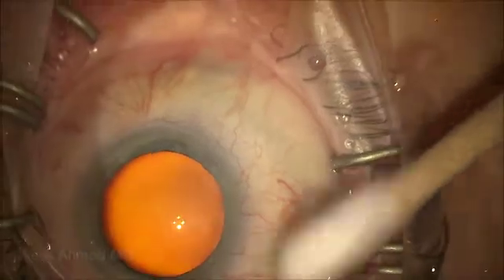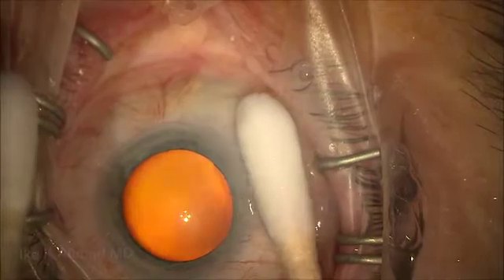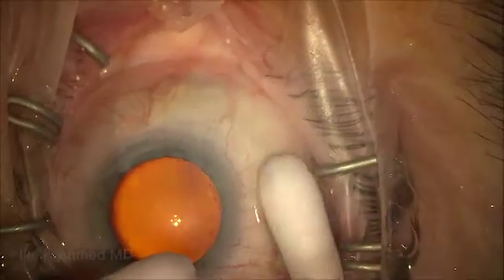The goal here, of course, is to create a more posterior bleb, and the area of application is in the supranasal quadrant, which will be the area where the Xen will be intended to be implanted. Having the patient look down again and rotating the Q-tips to keep the mitomycin away.